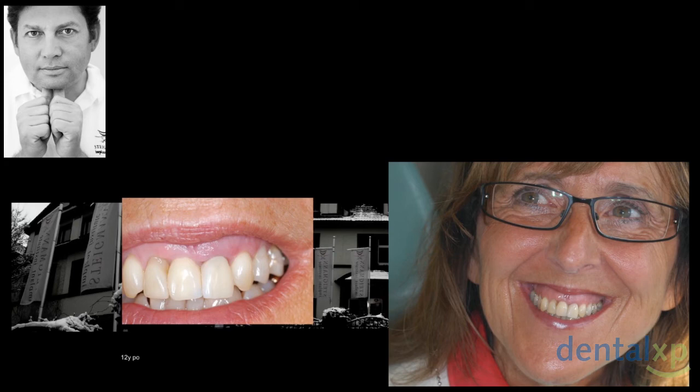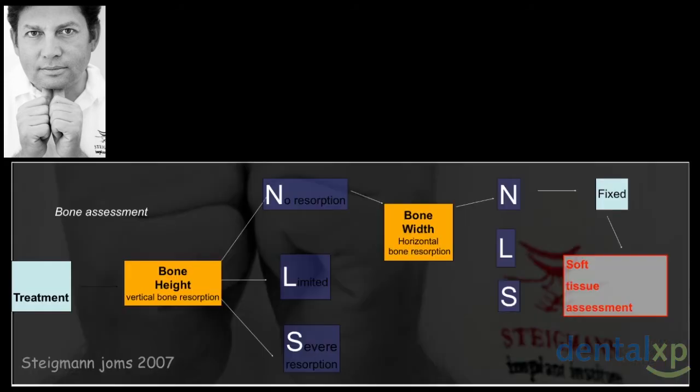We put it to the interproximal bone, and the papilla came back, but we knew how to create those pressures. Now let's move to multiple implants. You can see multiple implants according to a publication we did also 10 years ago. The soft tissue management makes sense when you have the interproximal bone.